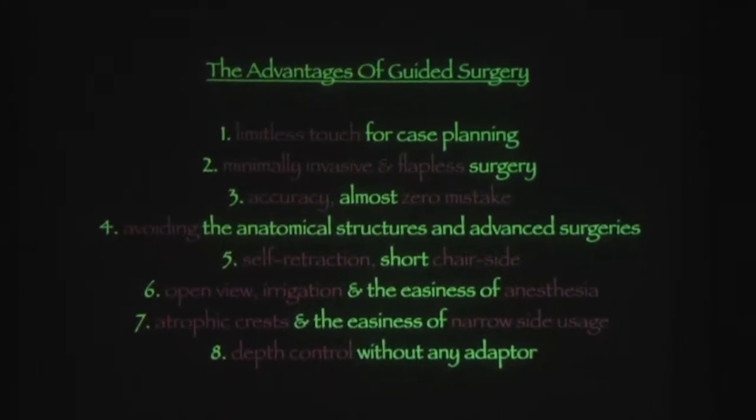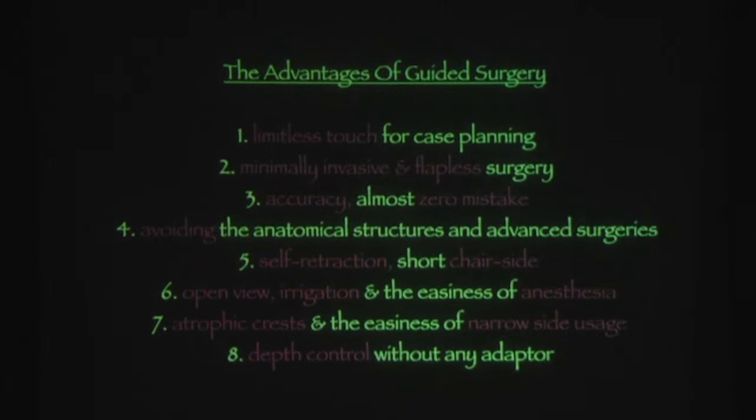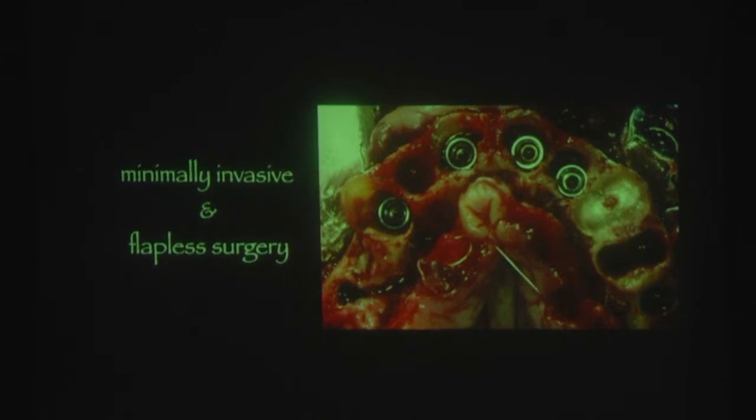So, the sixth one is open view irrigation, the easiness of anesthesia. The seventh one, the atrophic crests, the easiness of narrow size usage. And the last part, depth control. It's very normal, but it is without any adapter. So, minimally invasive. This is not a guided flap surgery. I have so many surgeons, and they are so skillful. They have so many skills, and they like to open big, and they tell themselves and the others, a great surgeon opens great. A big surgeon opens big.